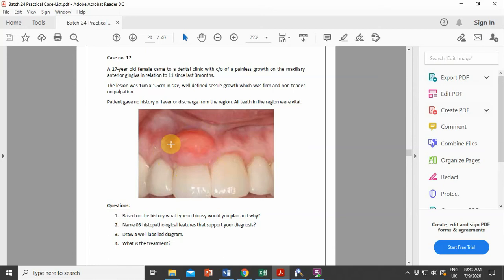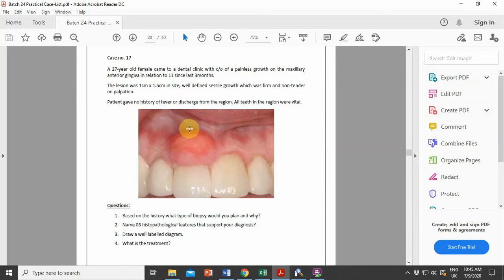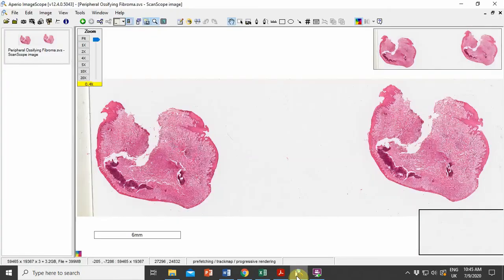Here you can see a sessile growth on the gingiva measuring one centimeter by 1.5 centimeters, present since three months. To evaluate this lesion, we prescribed an excisional biopsy. Once the biopsy specimen is processed, it can be studied histopathologically. Here is the digital slide for case number 17.